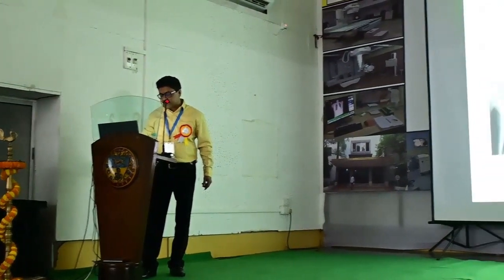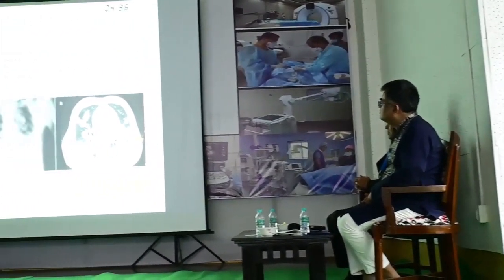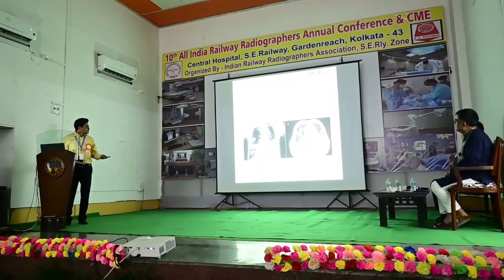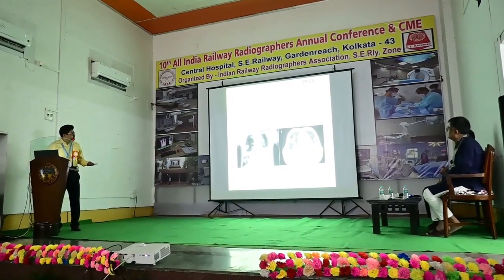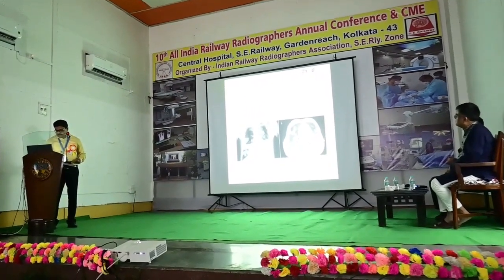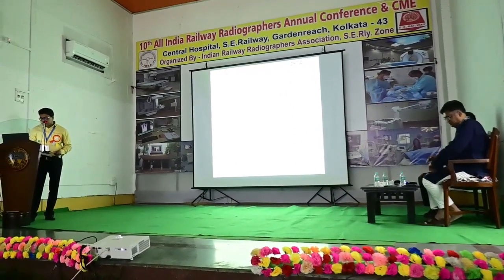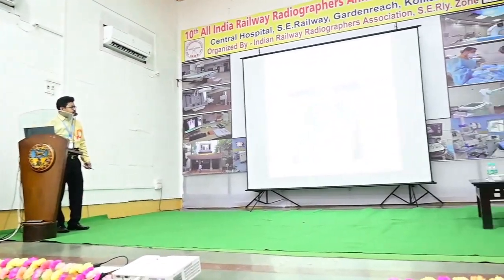Like cannonballs. It also has a French term that translates to balloon release, also used to describe the same appearance. And the appearance is like this, the cannonballs in CT axial scan, and in X-ray this is the appearance. Cannonball lesions in lung fields are most commonly due to hematogenous spread of a primary malignancy elsewhere. Can it be an artifact?